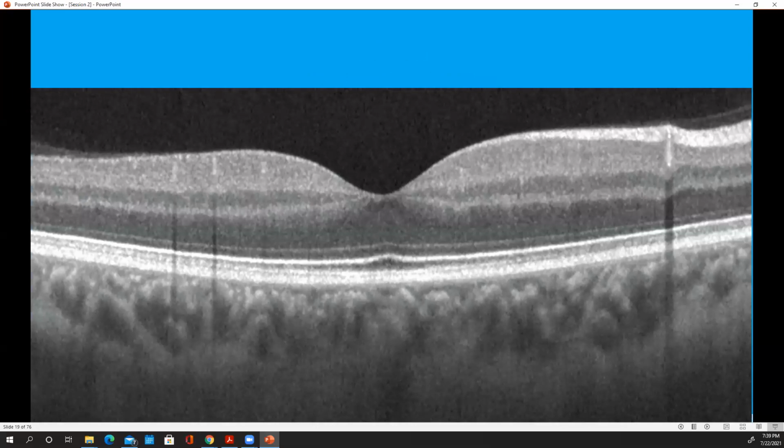So I'm going to point to something. Instead of saying dark or light, you're going to say whatever you pick, nuclear or cellular for dark, and then plexiform or axonal if you want for light. Okay. So we're going to point to that one.